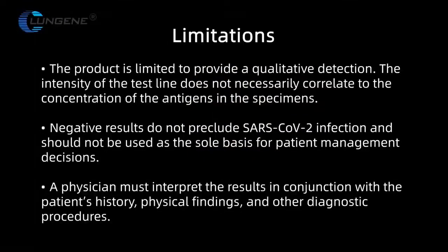Limitations. The product is limited to provide a qualitative detection. The intensity of the test line does not necessarily correlate to the concentration of the antigen in the specimens. Negative results do not preclude SARS-CoV-2 infection and should not be used as the sole basis for patient management decisions. A physician must interpret the results in conjunction with the patient's history, physical findings, and other diagnostic procedures.